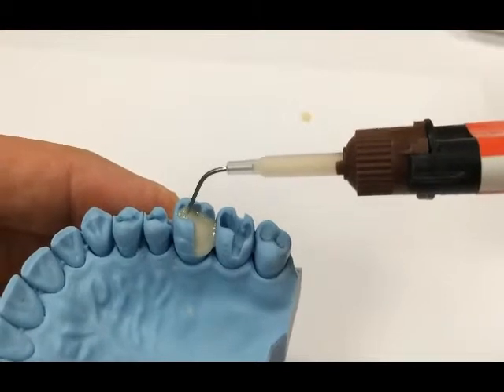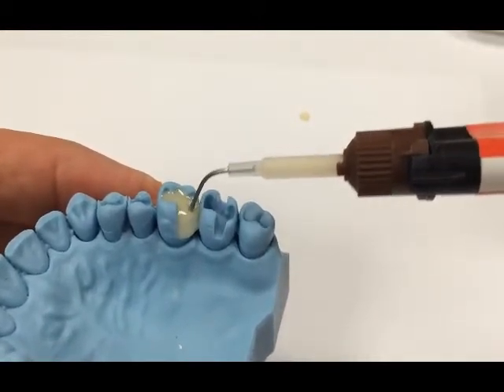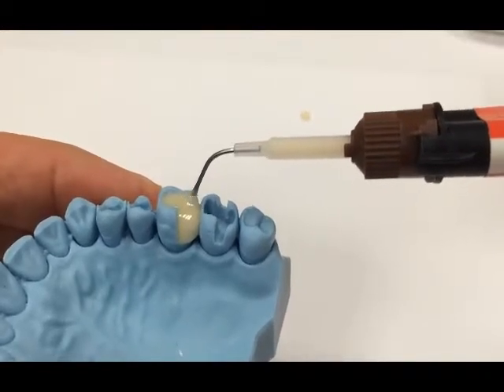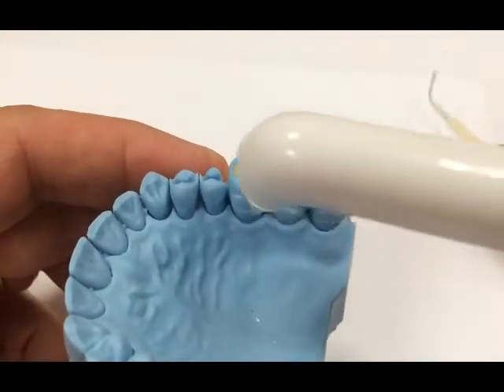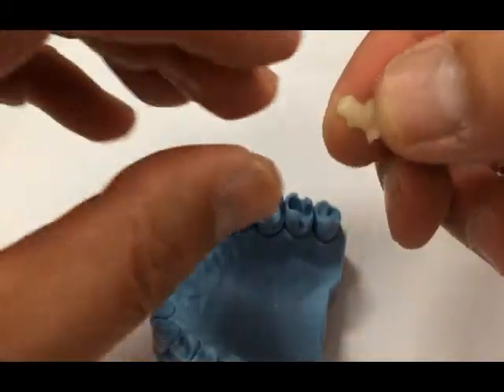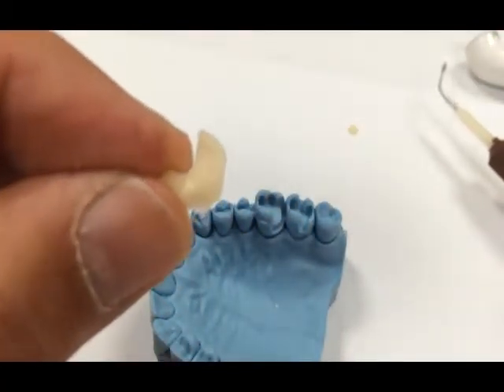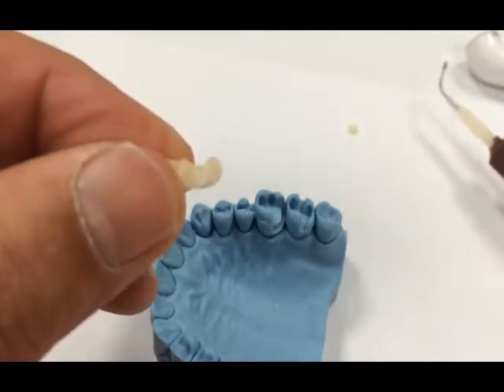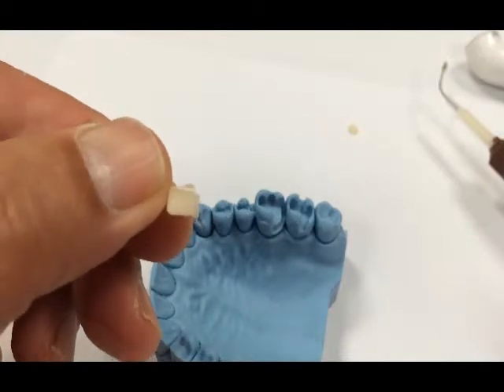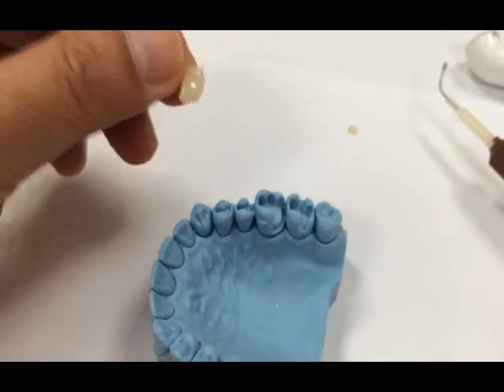Once you get the hang of it, you can do this procedure quite fast — as you can see, it is going quite rapidly. A bulk fill of this material demonstrates its ease of use and application. Once you're at where you want to be, remove the tip and light cure for 20 seconds. When finished, the restoration is removed from the model so you can see the accuracy with which the material has adapted. The detail in the material is literally taking a fantastic impression of what's going on in the box. This is the best way to use Activa restorative with the metal cannula.